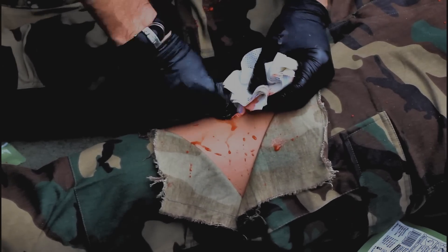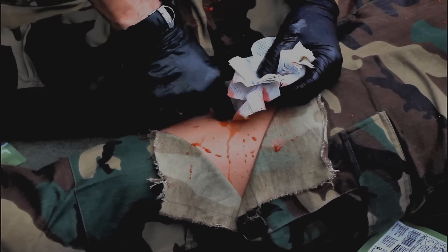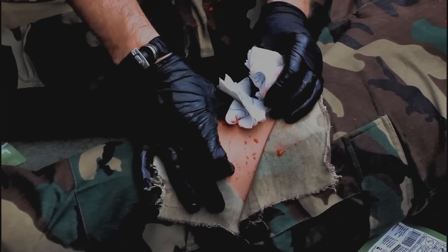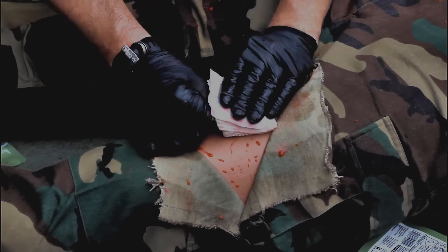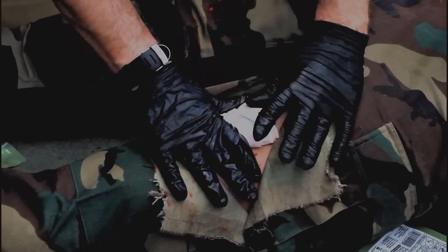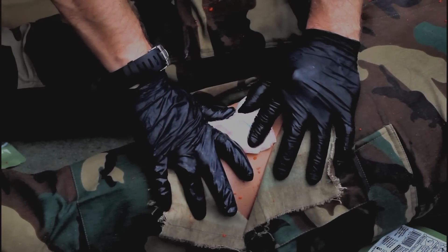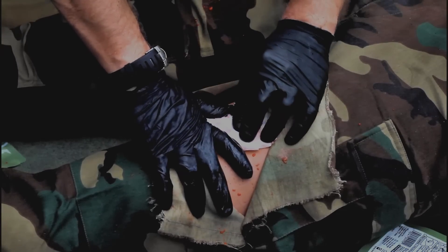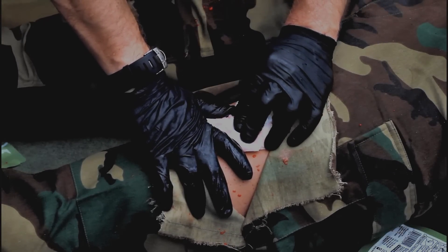Excess pooled blood should be swept away, the point of bleeding should be visualized if possible, and a fresh combat gauze should be packed into the wound consistent with the product instructions. Remember that once the new combat gauze is packed into the wound, you must still apply at least three minutes of pressure before proceeding with the application of a pressure dressing.